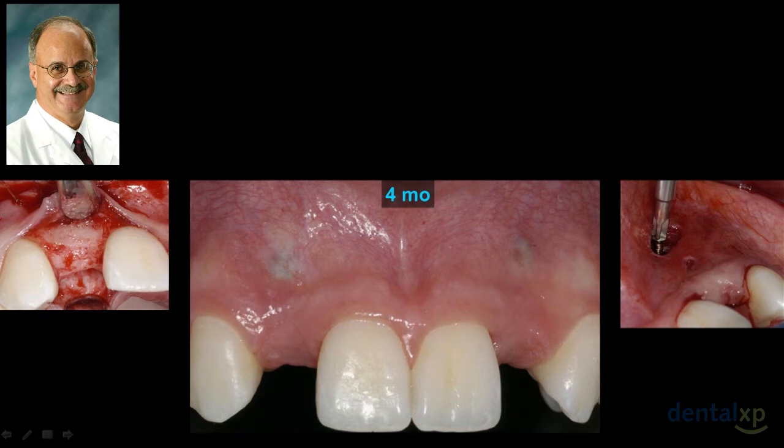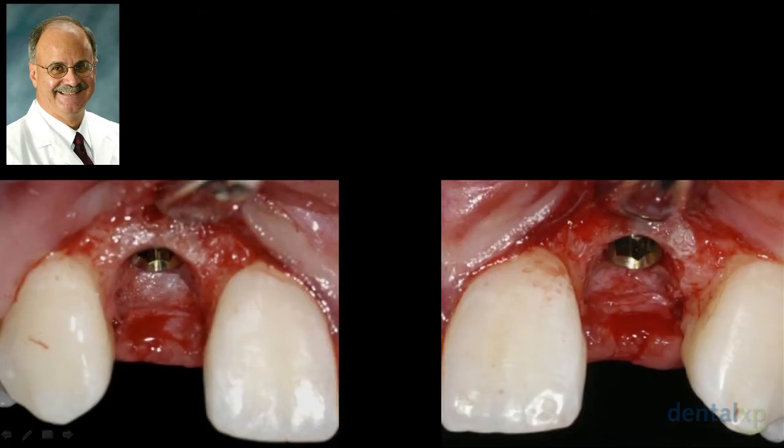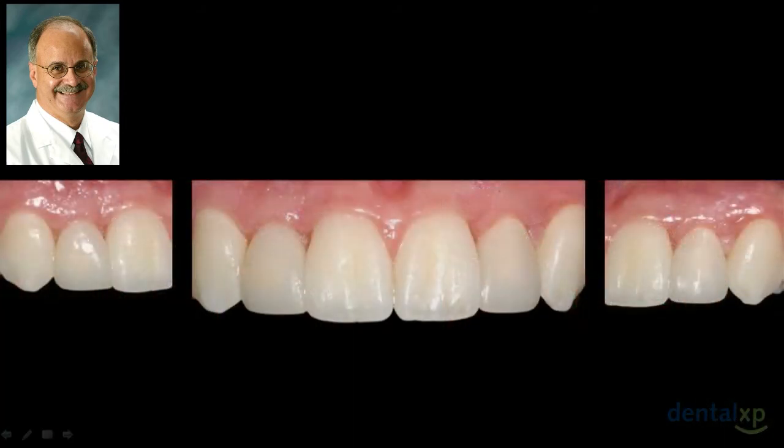And that way we minimize our flap elevation to what? Just crestal. Why crestal only? Well, heck, we can contour our bone like you see here and put the implant body in 3 dimensions exactly where it needs to be. And as Dennis and Stephen so nicely have shown, and we've known a number of these types of protocols over the years in terms of exact implant placement three-dimensionally, you can only do that with some flapping and contouring. If we did this completely flapless, I'm not sure how you can obtain that kind of a result. But most importantly, 3D, we know where things are at.